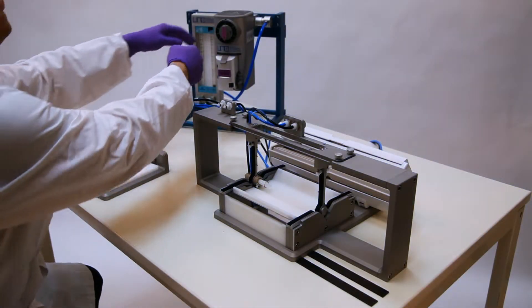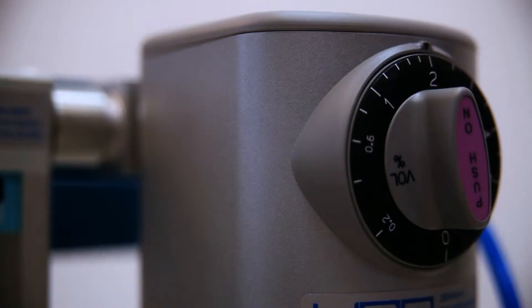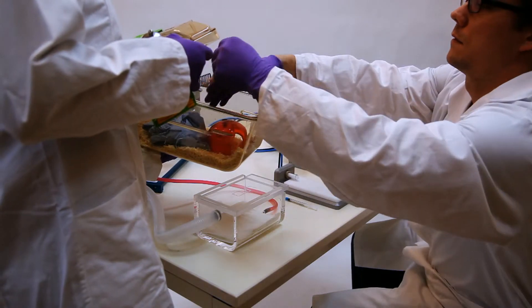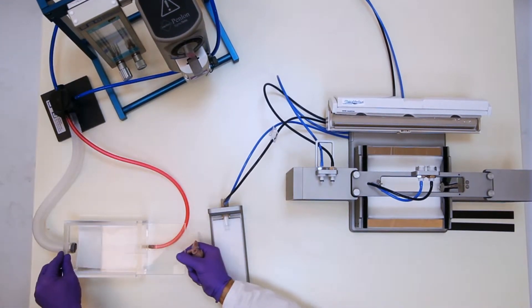For animal preparation, the imaging system comes with a dedicated station that connects to any commercially available anesthesia unit. The animal is put to sleep in an induction chamber.